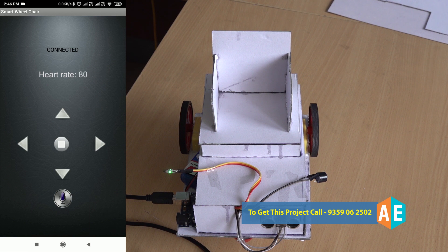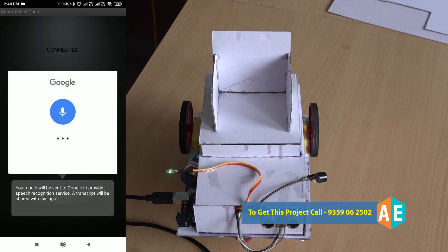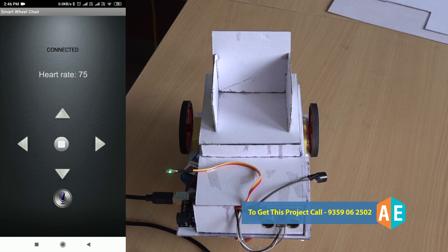This wheelchair can be controlled with the help of two options. The first option is button control, where you can move forward, backward, left, right, and stop the wheelchair. The second option is voice commands using Google speech recognition, where you can speak commands like go, backward, left, and right to control the wheelchair.